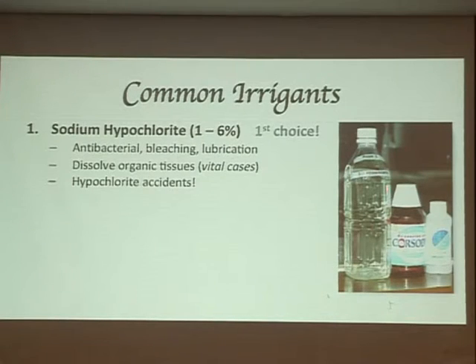There's a thing I use. It's not water, okay, it's hypochlorite, it's a bleaching agent. I'm using a 1:1 concentration. So 1 part of bleach mixed with 1 part of distilled water. So it's about 3%. Somebody asked me why 1:1. It's not evidence based. I just make my life easier, make my nurse's life easier. Okay? If you tell the nurse 1 part of bleach, 5 parts of distilled water, they do it correctly the first day. Second day they mix it up, 5 parts of bleach and 1 part of water. Okay? So 1:1 mix. So it's easier.